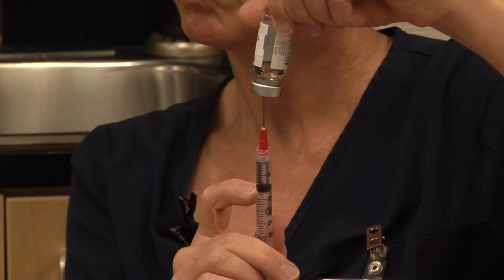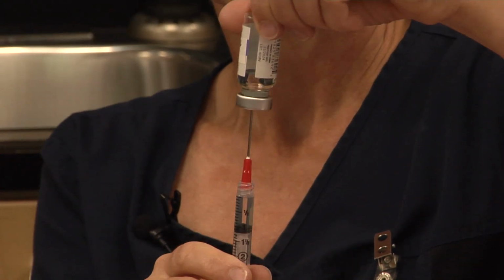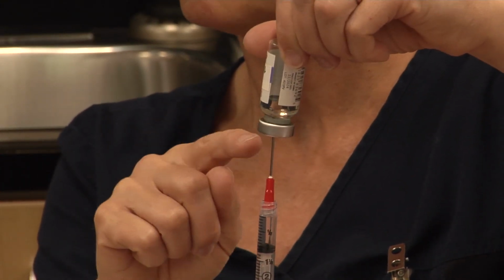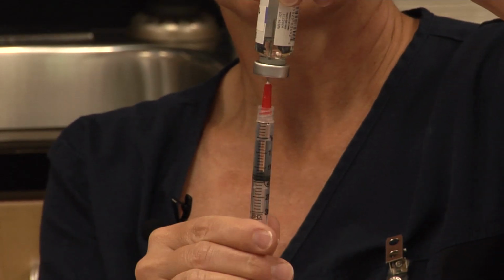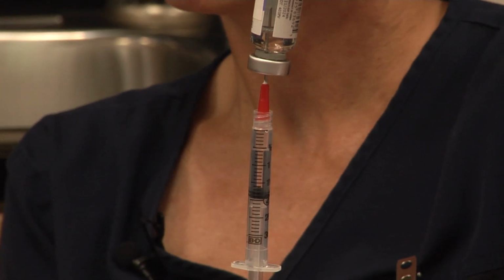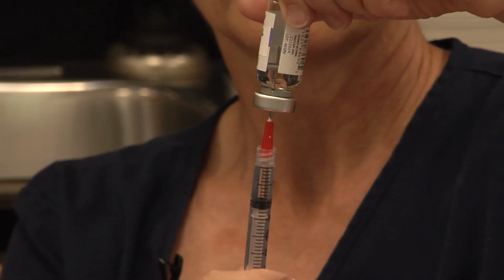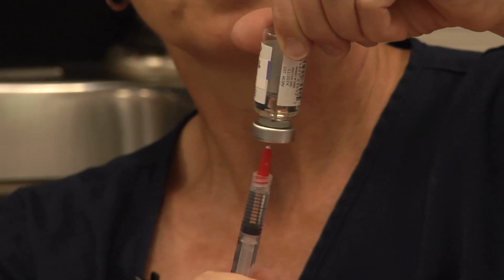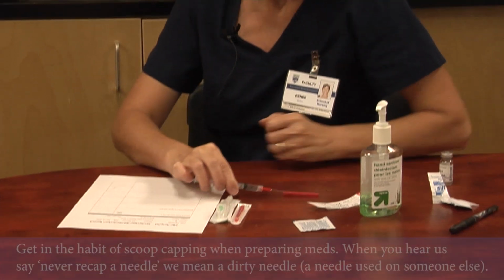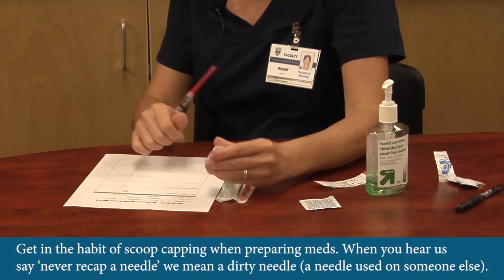Okay, so I have my 1 ml. If you got a bunch of air in there, can you push it back into the vial? Definitely, because the system is all closed. Let me just show you that for a sec. You can see that there's air there. I can simply inject it back and then correct my volume here. Oh, great. I'm going to scoop cap again. I'm going to double check.